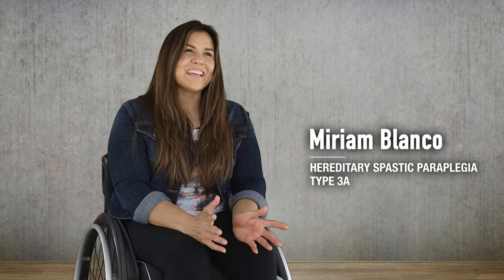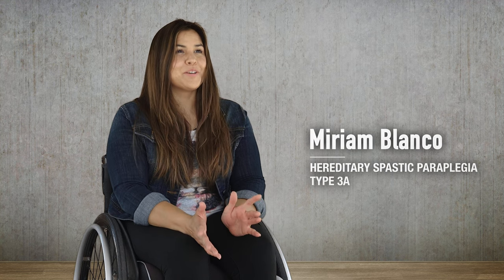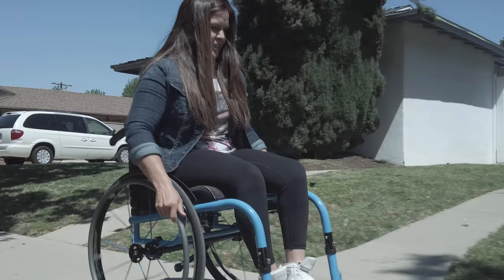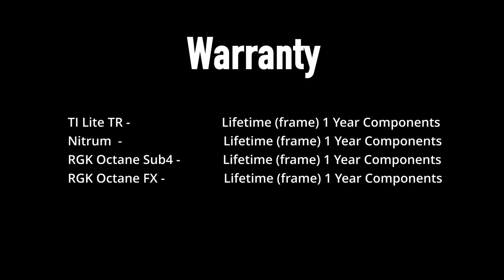The Octane FX by Sunrise is really cool because it folds down into a very compact space, which would be great for travel. This is new to the U.S. market — it's a rigid chair that actually folds into a very compact size. Most manual chairs have a similar warranty, but make sure you thoroughly investigate warranties when buying a new chair.